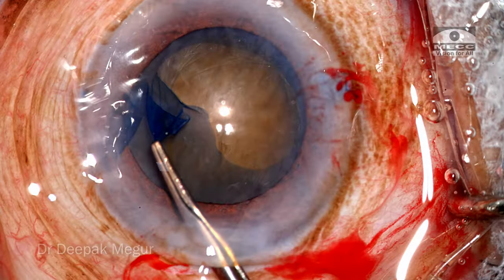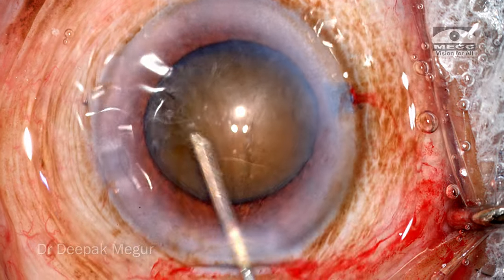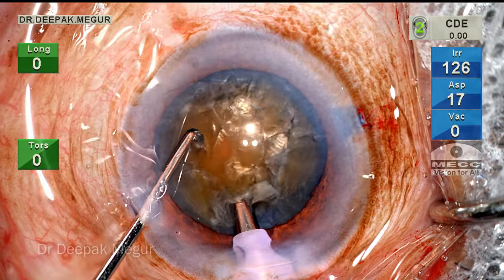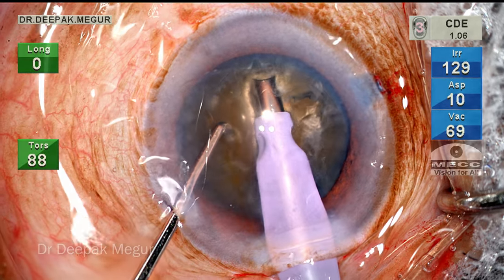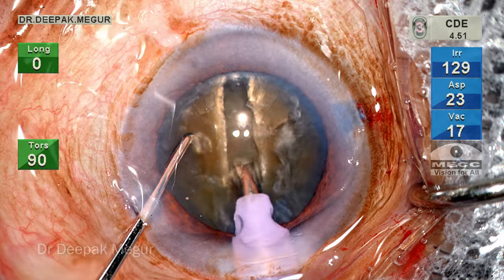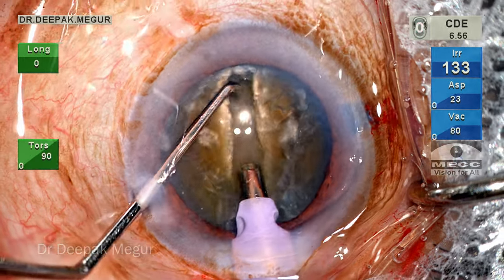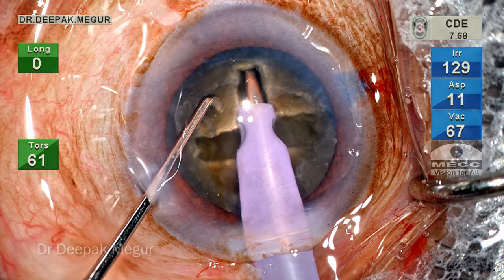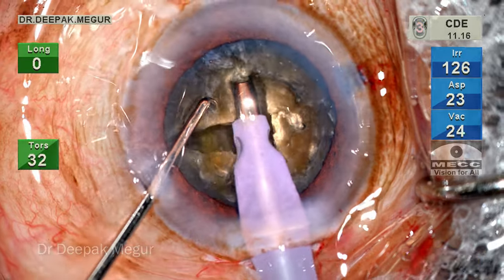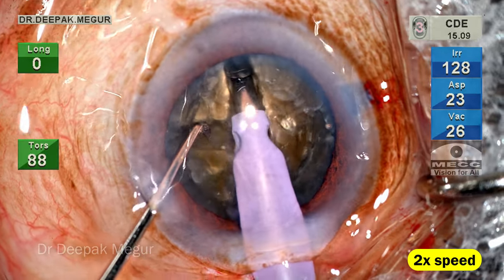Coming to the problem at hand: as is my routine nowadays, I'm preferring the classical divide and conquer four-quadrant technique in such dense cataracts. According to the plan, the rhexis is done and I'm just doing sculpting now. The nucleus can be sculpted best when we support it with the second instrument using a chopper or a Sinskey hook. The tip is exposed slightly longer than usual and the trenching is continued.